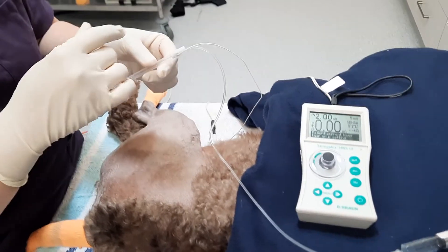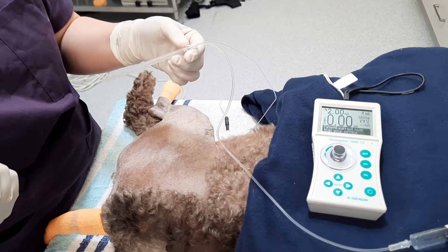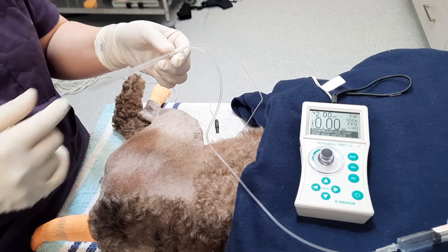Hello everyone, my name is Anna. I'm one of the rotating interns here at South Paws. Today we're just going to show you how we do sciatic and femoral nerve blocks.